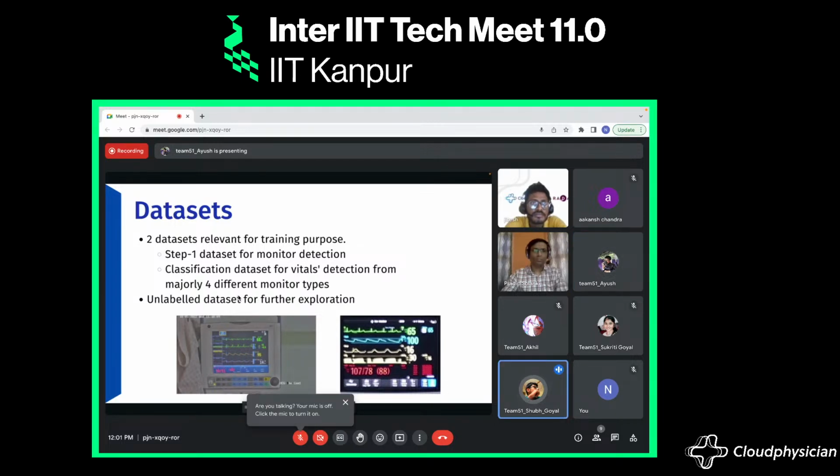We were provided with three different datasets. The first had 2000 images of monitors along with the annotations of the monitors present in the images, as shown in the first image. The second was a classification dataset, which had 250 images each of four different types of monitors along with annotations of the given vitals and the graphs. And finally, a third dataset of 7,000 unlabeled images was provided for further exploration of the model. And now Sukriti will explain the pipeline.